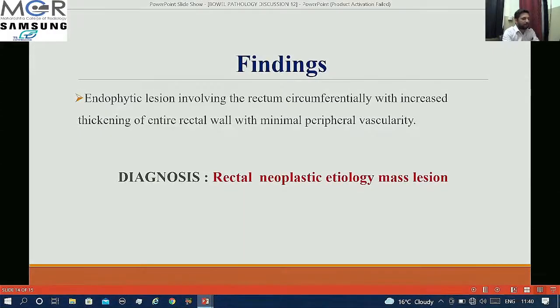There is an endophytic lesion involving the rectum circumferentially, with increased thickening of the entire rectal wall and minimal peripheral vascularity on color Doppler. So my diagnosis is rectal neoplastic etiology — a mass lesion.